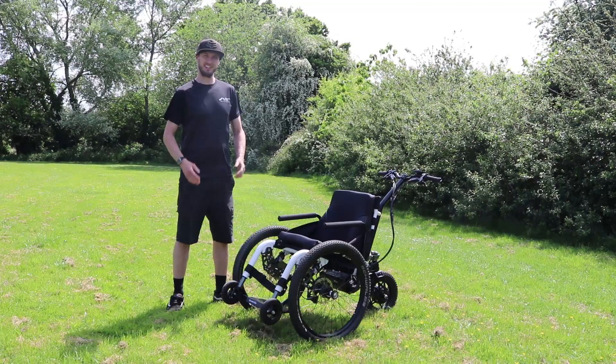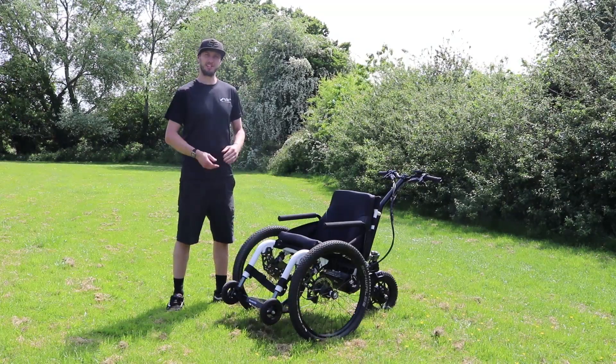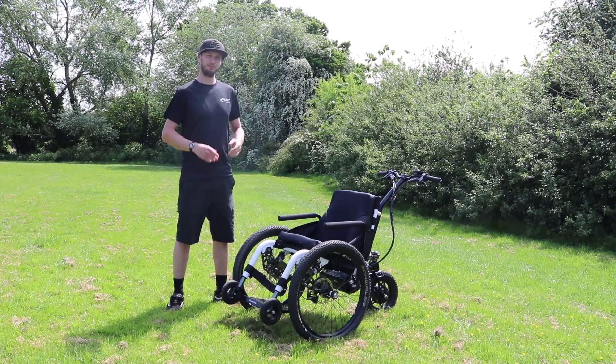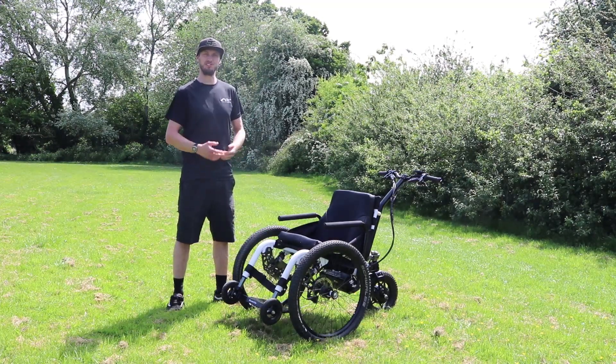Hi, I'm Tim from Mountain Trikes. In this video I'll be talking all about our E-Push, our Electric Assist Attendant Wheelchair. I'll be talking through its features and how to use it.